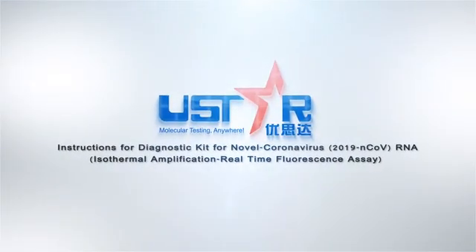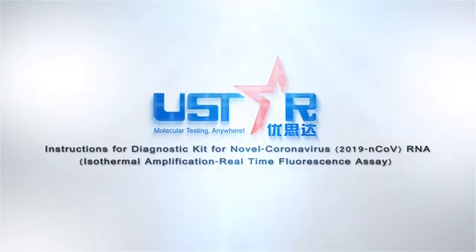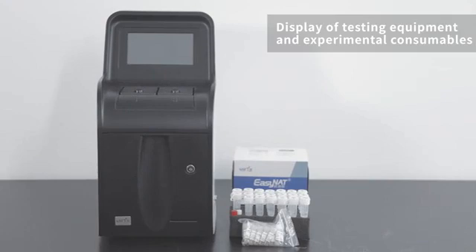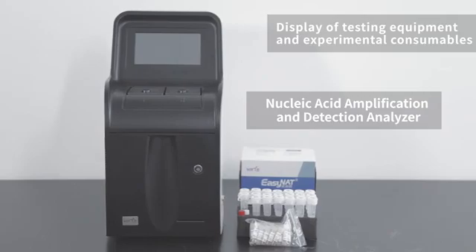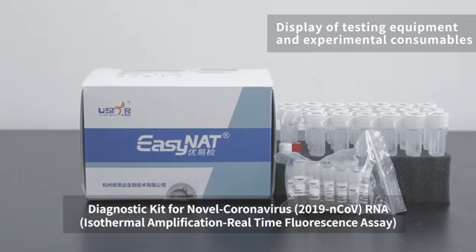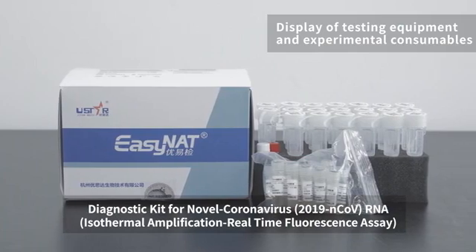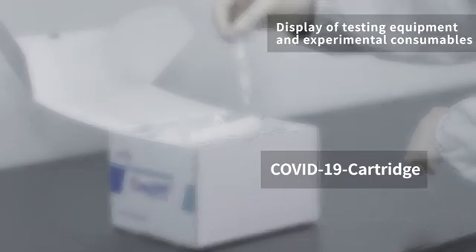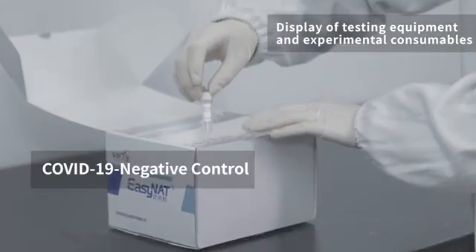Introduction for diagnostic kit: novel coronavirus RNA isothermal amplification real-time fluorescence assay. Display of testing equipment and experimental consumables including the nucleic acid amplification and detection analyzer, disposable sample collector, COVID-19 cartridge, COVID-19 RNA extraction solution, COVID-19 negative control, and COVID-19 positive control.